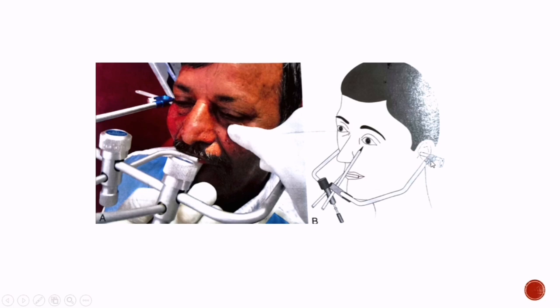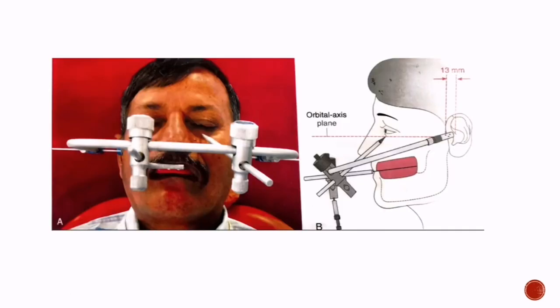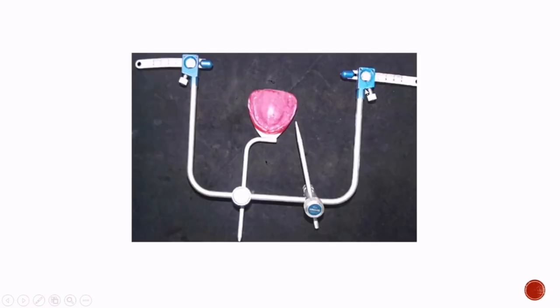The condylar rod readings are equalized on both sides and the locking screws are tightened. Following this, the orbital pointer is also tightened in position. Once the entire apparatus is in position, the condylar rods, orbital pin, and bite fork are verified for any movement, alignment, and parallelism. The contoured mandibular occlusal rim may be used during the transfer to stabilize the maxillary rim. The face bow record is removed from the patient by loosening only the condylar screws, and the record is now ready to be mounted on the articulator.